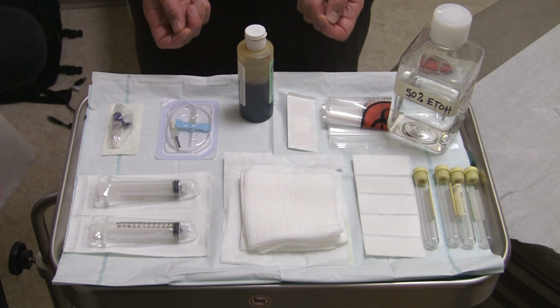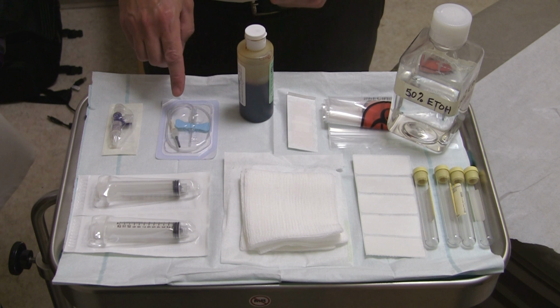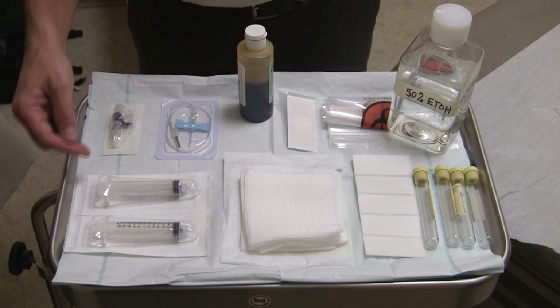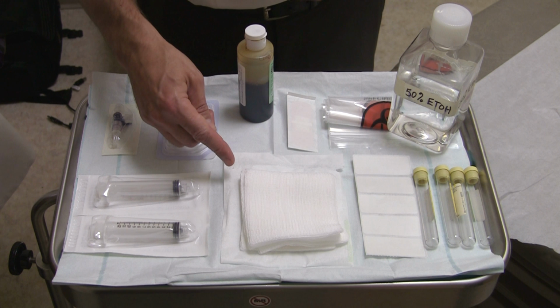These are the materials used to access the Ommaya. The smallest butterfly needle should be used. This butterfly needle is 23 gauge. A three-way stopcock will be attached to the needle, and these two 10 cc syringes will be attached to the stopcock. Syringes larger than 10 cc's are unnecessary. The gauze will be infused with betadine and then used to thoroughly clean the Ommaya site before access.